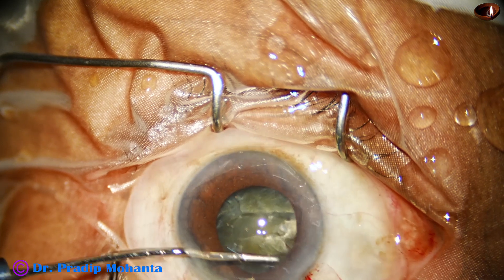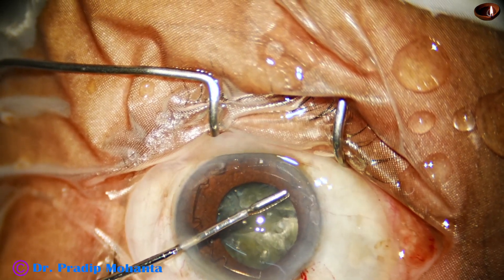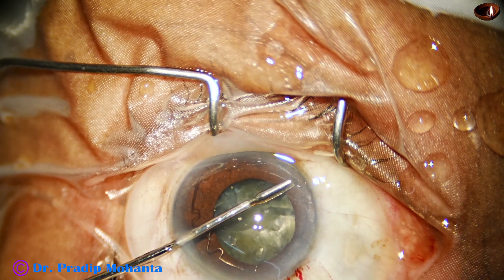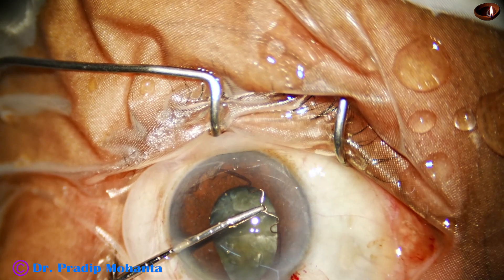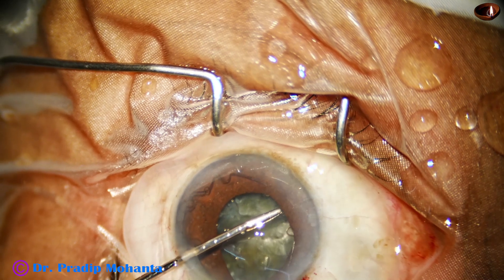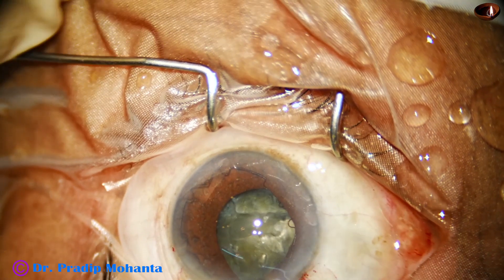And we can ask the inventor, Dr. Subin Bhattacharji, about this — whether B-Octa is better than B-hex in such cases.